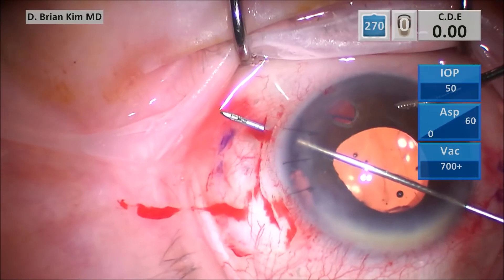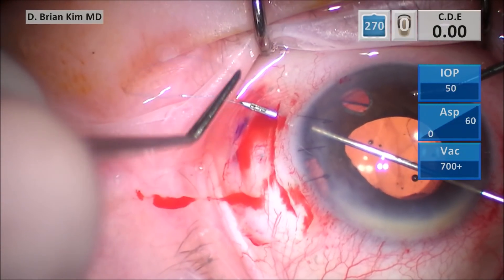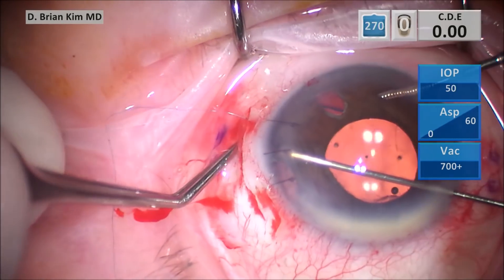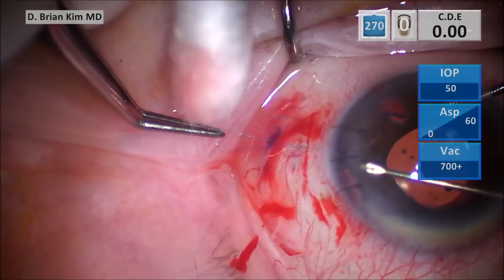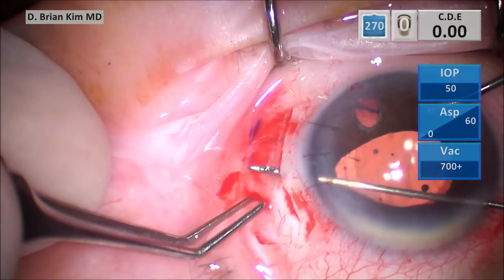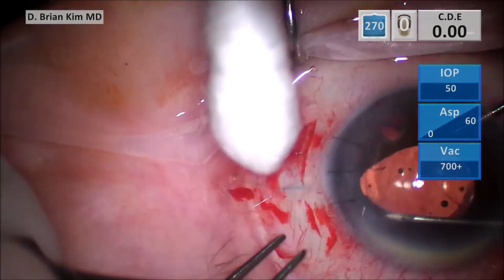You're going to grab the suture and externalize it as much as you can. Then while holding the suture, you're going to internalize the needle again. You will go adjacent to that spot, pierce the adjacent iris, and then puncture through the scleral groove again. When you do that, you're going to grab more suture within the lumen of the needle. You repeat that same step a few more times as you march across the iridodialysis, going through that scleral groove each time. Stabbing the iris, emerging into the scleral groove — you grab with McPherson forceps the little loop of suture that is right there and hold it as you pull the needle back inside the eye. Grab the adjacent iris and stab it through the scleral groove again.